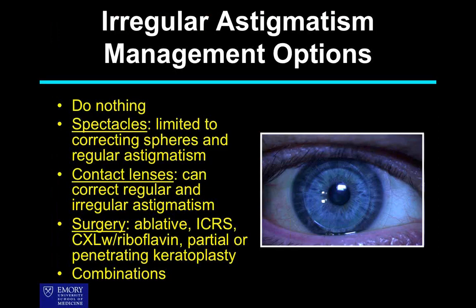Irregular astigmatism management: do nothing. In medicine, doing nothing is often a good thing. In keratoconus, not so much. Spectacles are limited to early keratoconus.